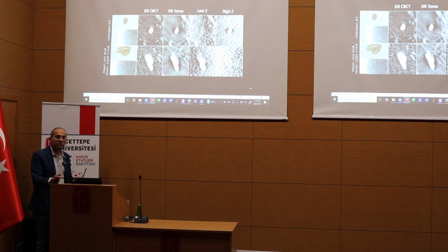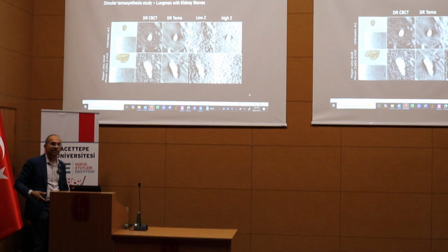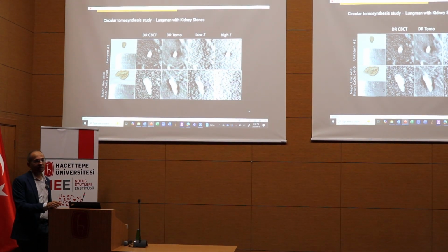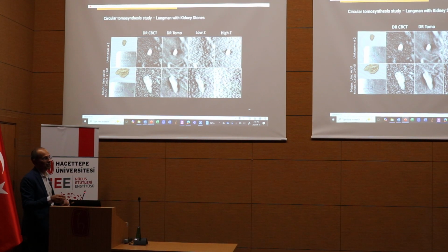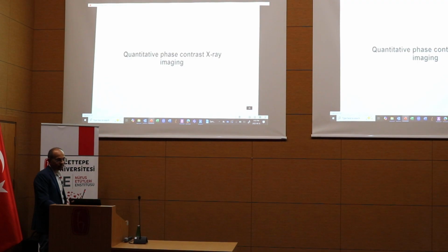So if you can see the stone and what that stone is in vivo at the hospital when you show up with a grade 10 pain in your kidney, it's better because the treatment can be started sooner, and you don't have to take your Tylenols and go home and deal with it until they finally do something to try and get the stone out of you. But this is a great way to do it in vivo.